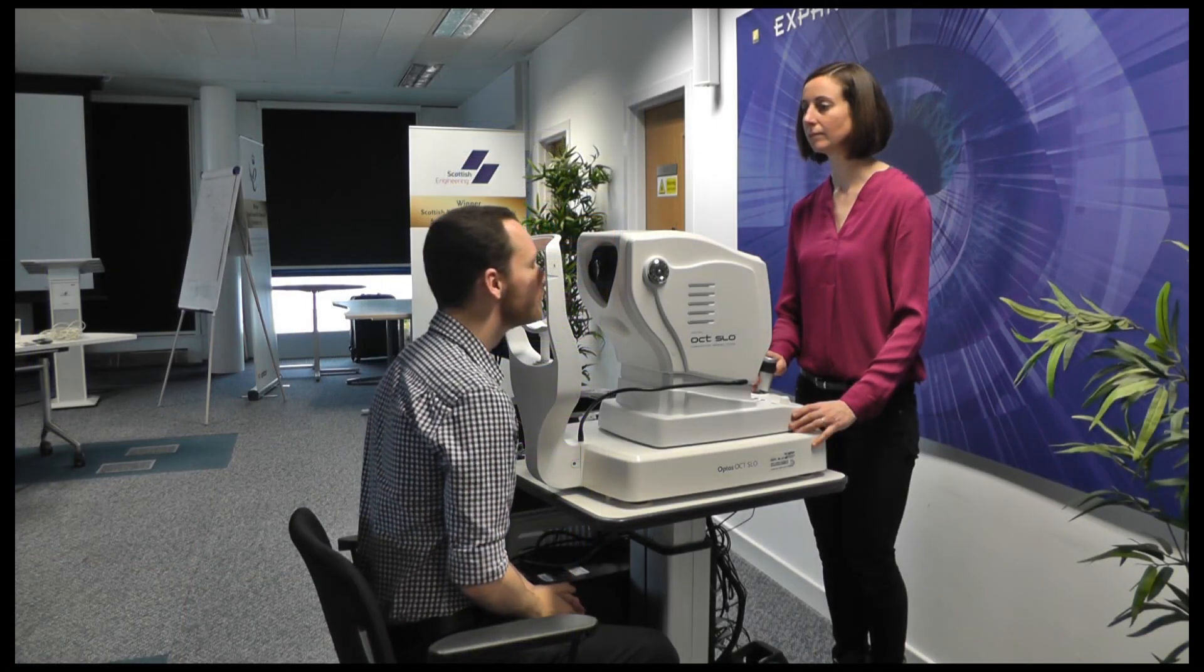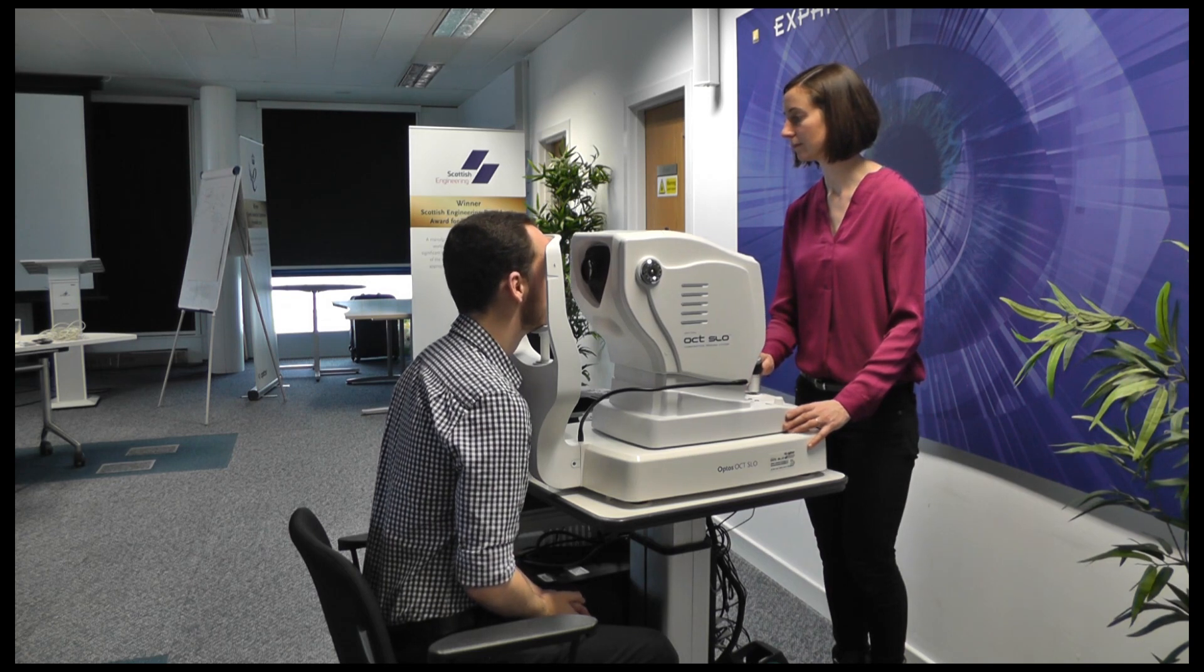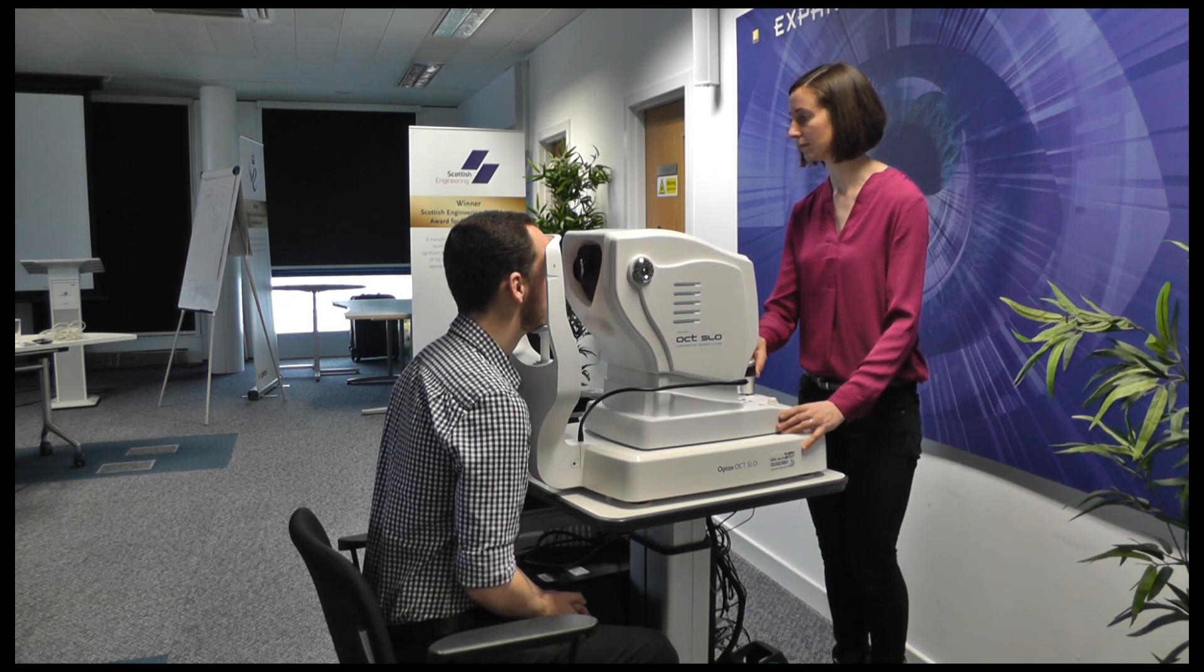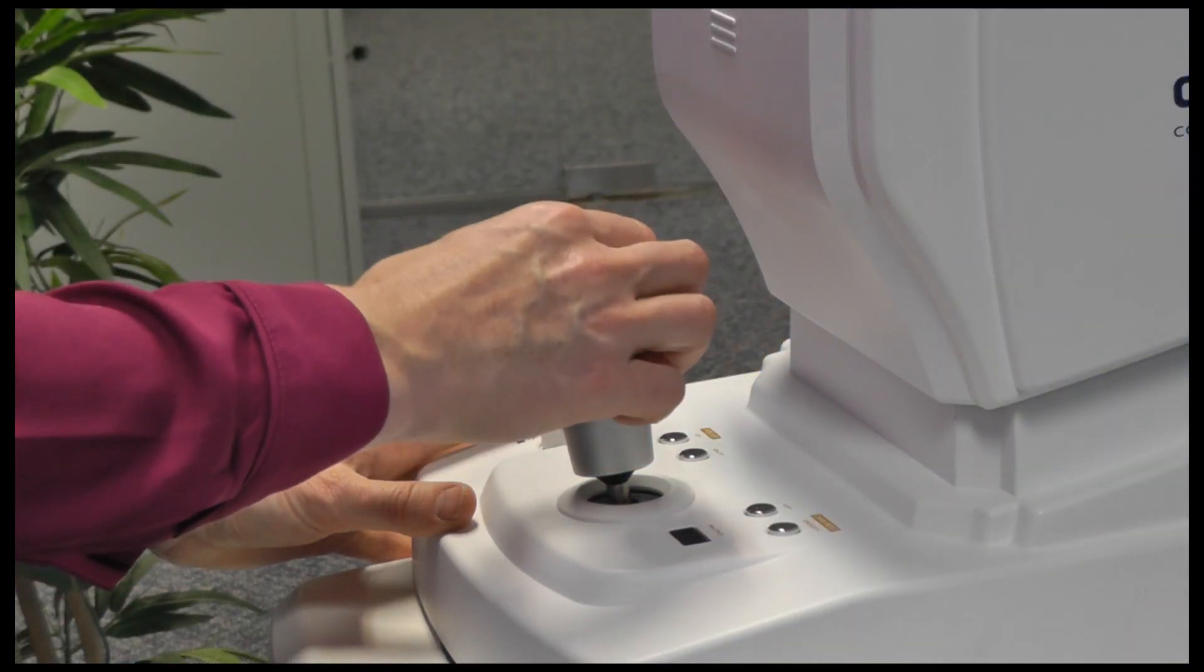The imaging procedure is simple. The patient sits down in front of the device and we use a scanning laser ophthalmoscope to take a 2D image of the back of the retina.